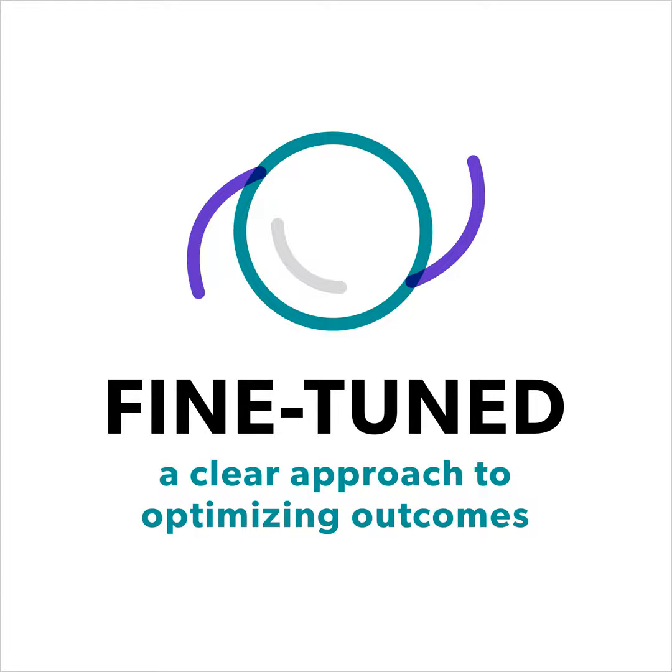High myopic astigmatism from -6.0 diopter to -11.0 diopter MRSE with cylinder between 0.0 diopter and -3.0 diopter in patients 21 years of age or older, and in patients with documented evidence of a change in manifest refraction of no more than 1.0 diopter in both cylinder and sphere components for at least 1 year prior to the date of preoperative examination. Hyperopic astigmatism up to 3.0 diopter MRSE with cylinder between 0.0 diopter and 2.0 diopter in patients 21 years of age or older, and in patients with documented evidence of a change in manifest refraction of no more than 1.0 diopter in both cylinder and sphere components for at least 1 year prior to the date of preoperative examination.